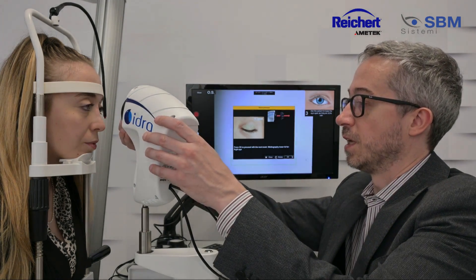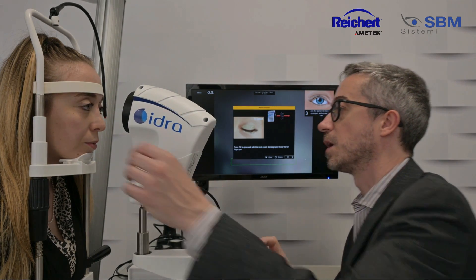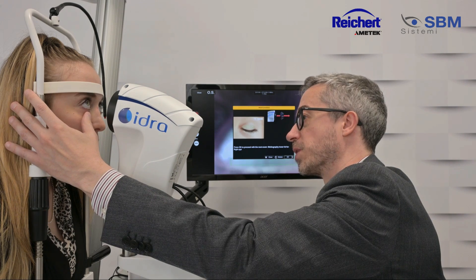Now, the use of the Hybrid Cone is over and we can start acquiring, as normal, the meibography.